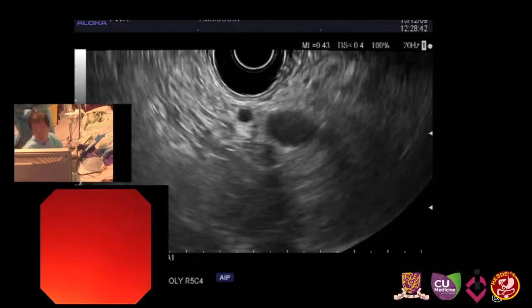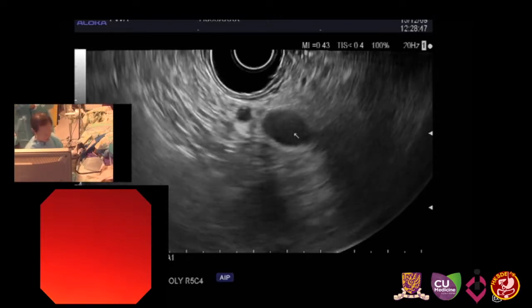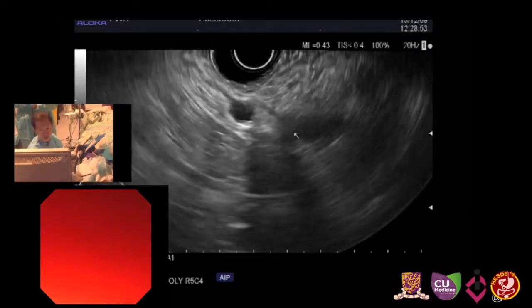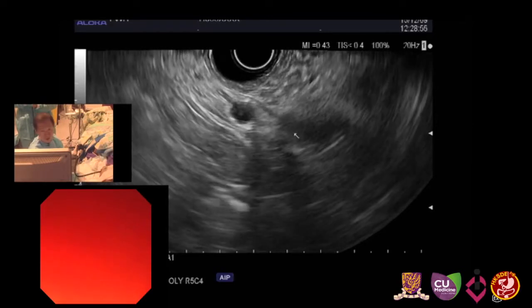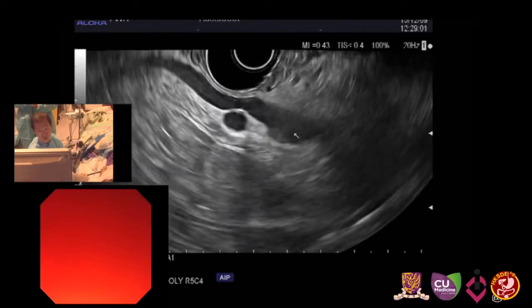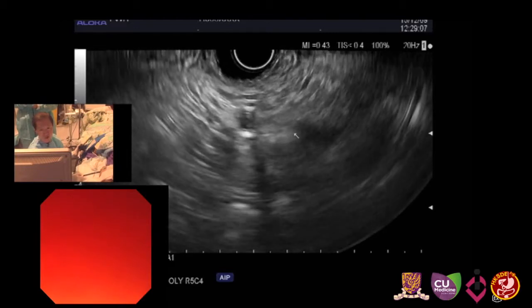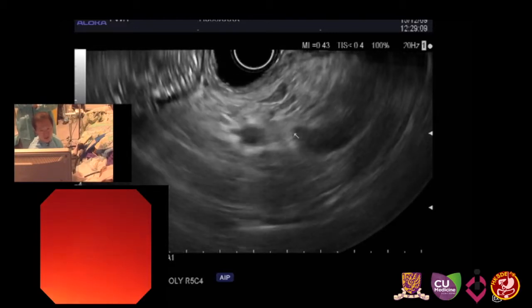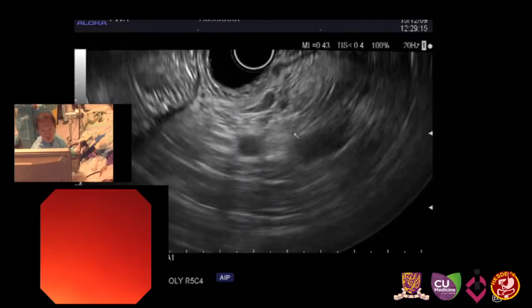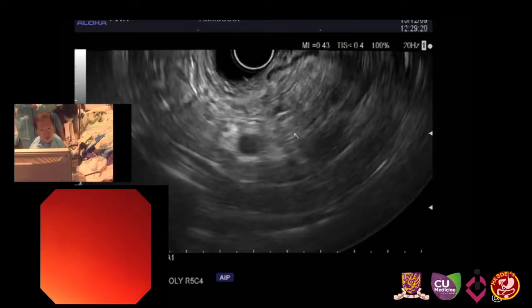Now we are trying to see the pancreatic area, head area here, superior mesenteric vessel here. So I'm trying to look at the head portion of the pancreas right now. But this maneuver should be very careful because frequently the scope tip falls off. So try to touch the pancreas as much as possible, and the slow, gentle pulling is generally enough. Now the scope tends to move away, but we are looking at the pancreatic parenchyma in the head area, but I think it will show.